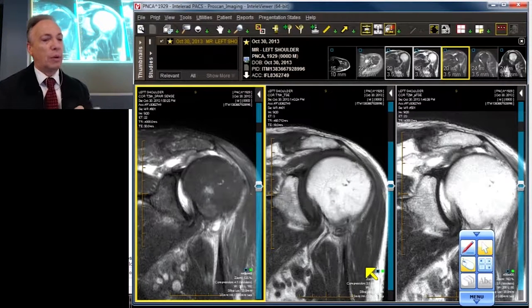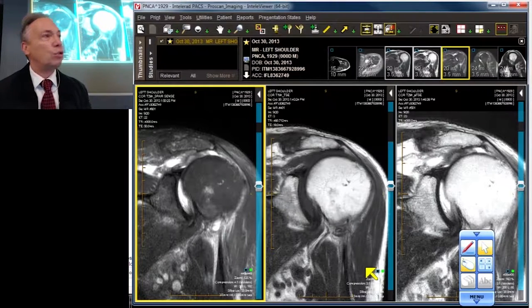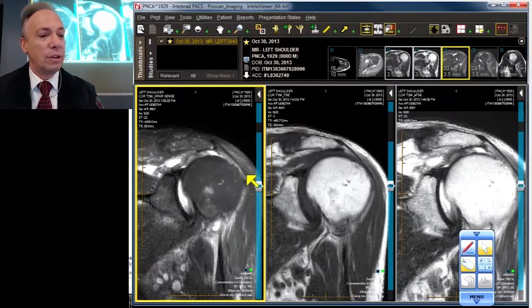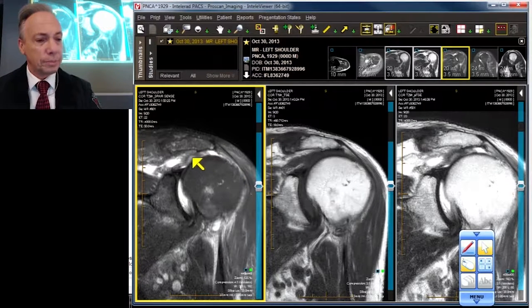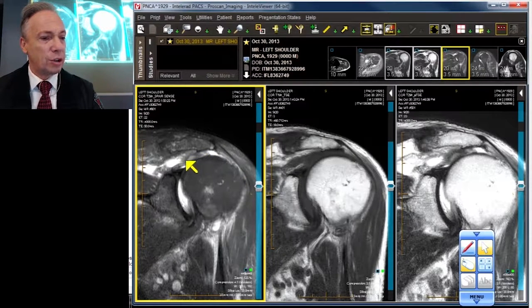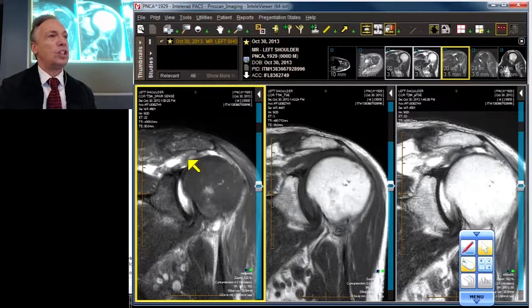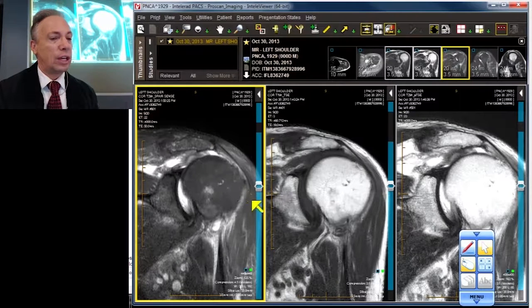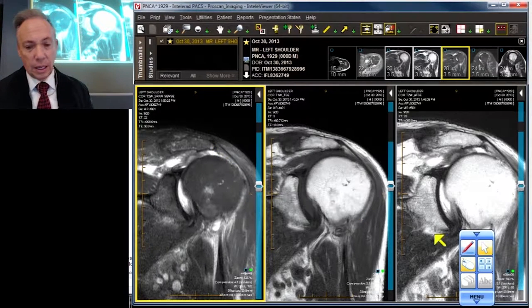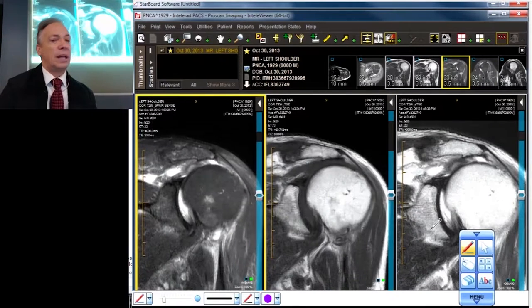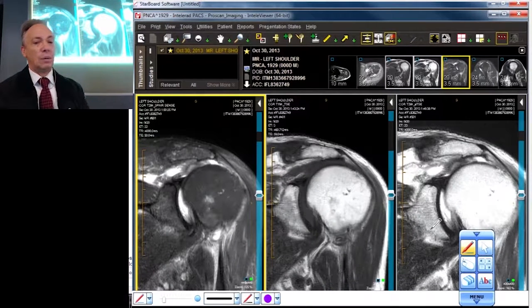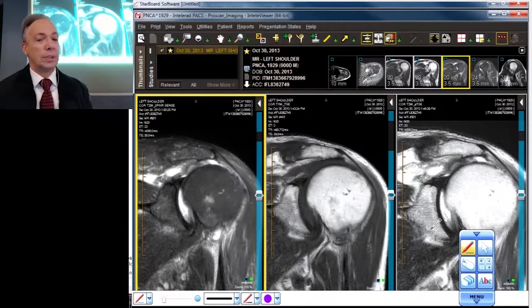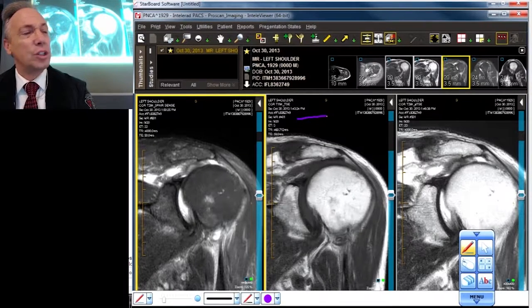Specifically, I want to focus on the sub-acromial arch. In this case of a massive rotator cuff tear, there is no supraspinatus — there is massive retraction with the fibers seen medially — and this was instigated at least in part by this unusual-looking acromion. The acromion has been a subject of much debate and discussion.